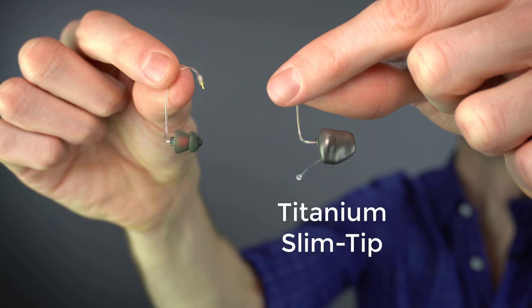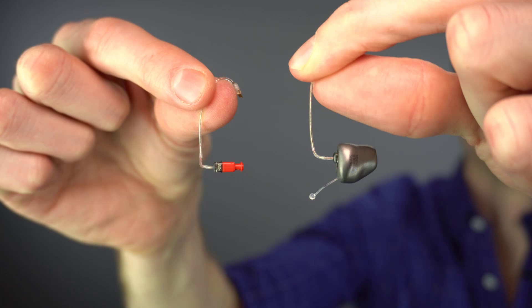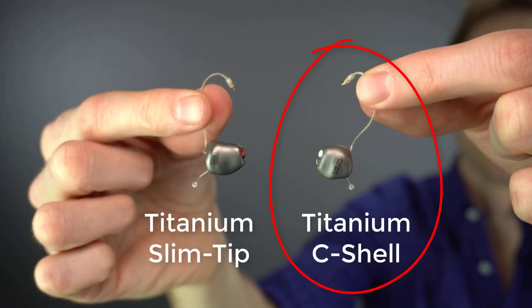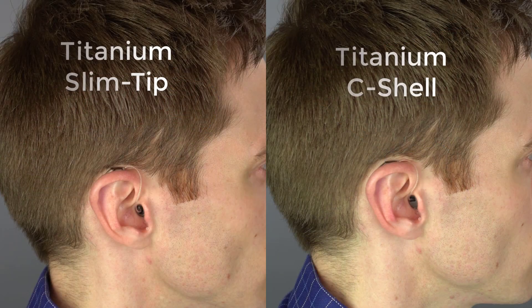The titanium slim tip is a custom ear mold that can be added to the end of a standard, medium, or power receiver wire, replacing a traditional dome for a more customized fit with a specific vent size if necessary. Using a slim tip is as simple as removing the dome and attaching the custom titanium ear mold. This is what a custom titanium slim tip looks like in my ear versus using a generic rubber dome. The titanium seashell is a little different because they actually embed the receiver inside of the ear mold, allowing for a really high quality custom fit, just like Phonak's acrylic version of the seashell, which I am also a huge fan of. Here is a comparison of the titanium slim tip versus the titanium seashell inside of my ear canals as I wear them.